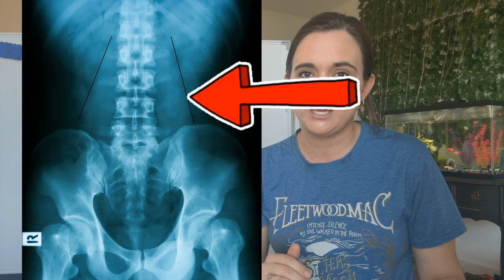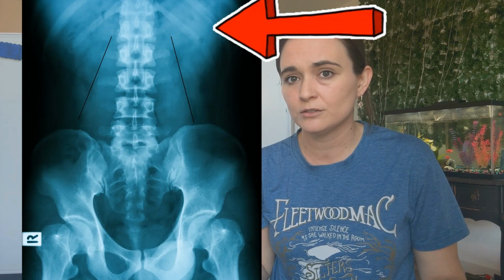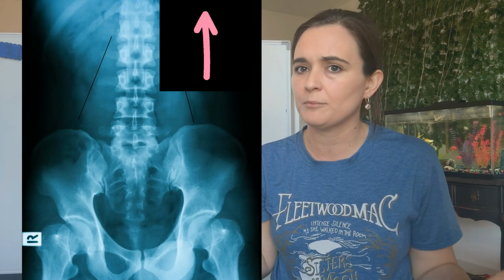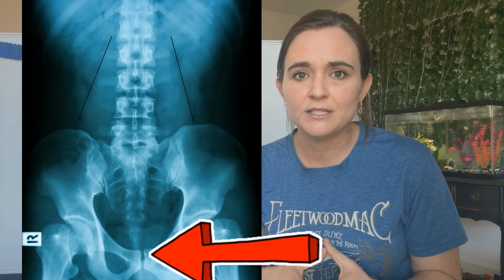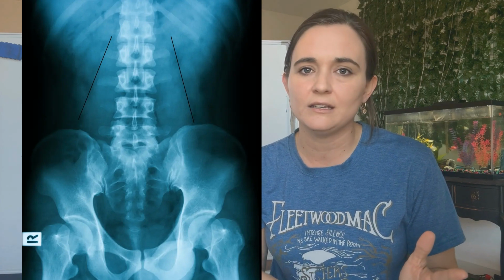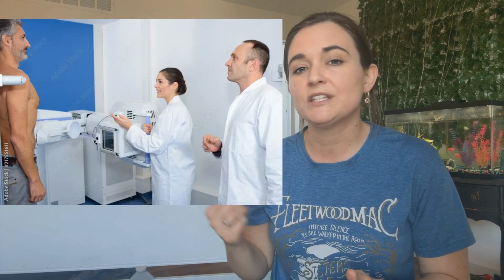Check for psoas shadows. Are they there? Kidney outlines, sharp or blurred? Bladder, visible? Diaphragm, clipped or complete? Symphysis pubis, included? If anything's missing, repeat it. This image is your foundation. Don't rush it. Now let's move to the AP upright.